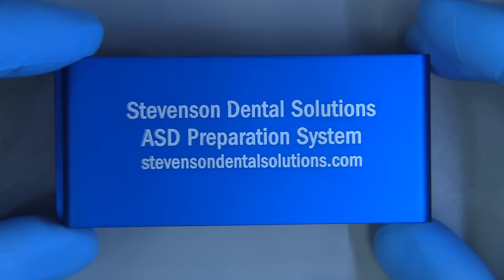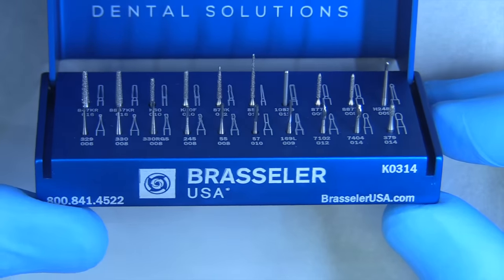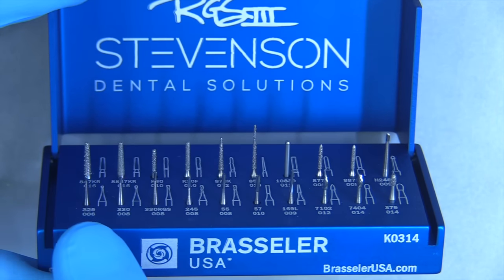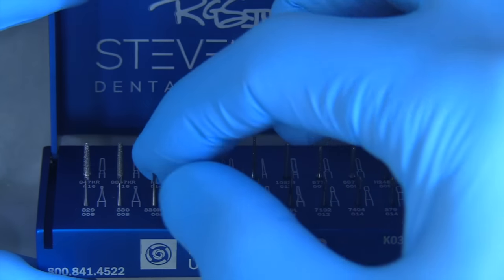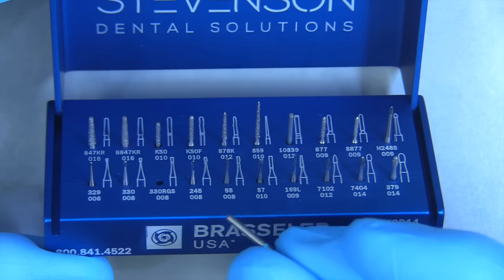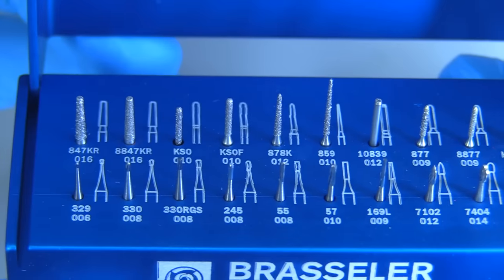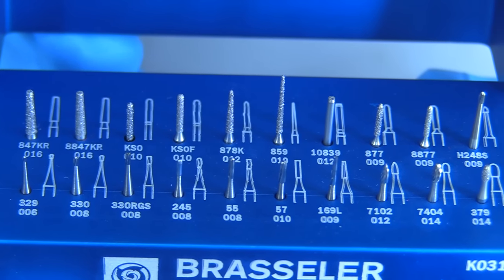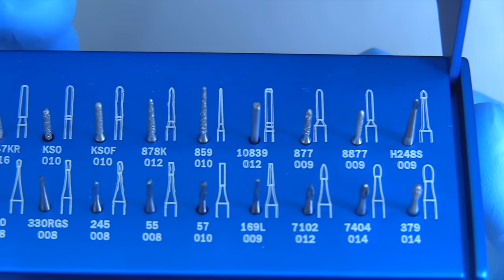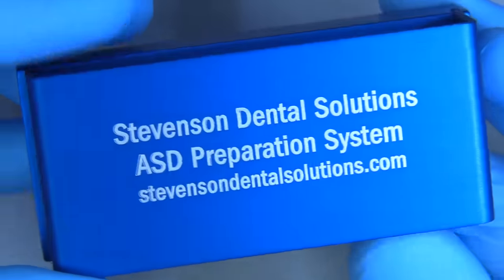Let's talk about the burs we would use. We have a bur block at our center that we use for everything from ceramic veneers to all-ceramic crowns, inlays and onlays, and direct restorations including composite preparations and amalgams. This is the third evolution of the bur block. Right there is a 330 RGS, which is a terrific bur for refining your class 2 preparations. The block has finishing burs for composites, shaping burs of different configurations, and the back row has mostly diamonds for indirect preps — full gold crowns, PFMs, all-ceramic inlays and onlays — plus an end-cutting bur and a bur for bevels on gold inlays and onlays.